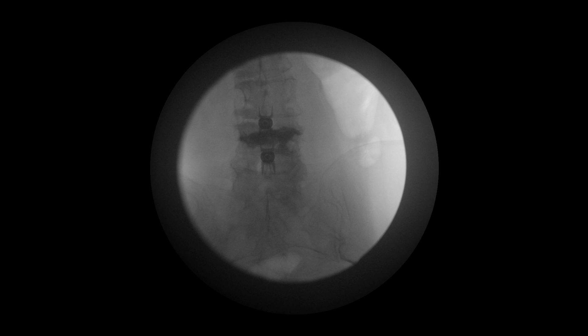The final images indicate successful deployment of the interspinous spacer at the L3-4 and L4-5 levels.